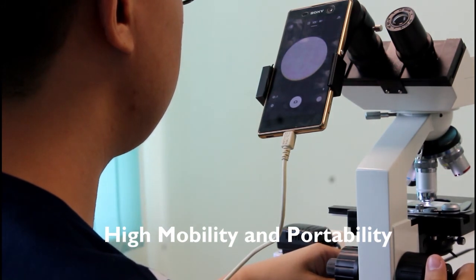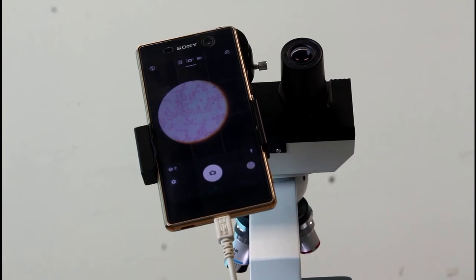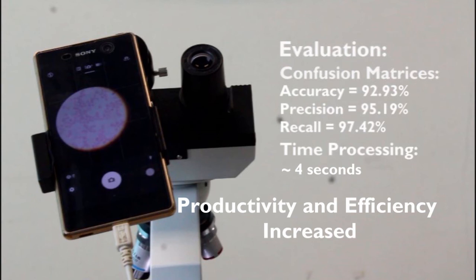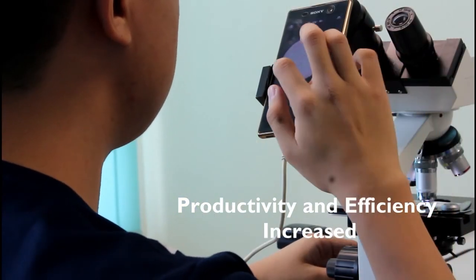By capturing 15 random blood smear images, the system was evaluated using confusion matrices and a built-in timer. The system performance is able to achieve up to 92.93% accuracy, 95.19% precision, and 97.42% recall with an average processing time of 4 seconds. Hence, this project increases the productivity and efficiency in blood cell counting due to the high accuracy achieved and less time consumed.